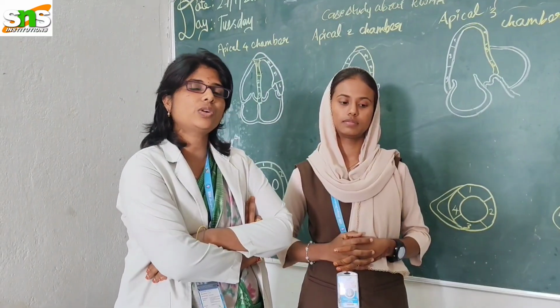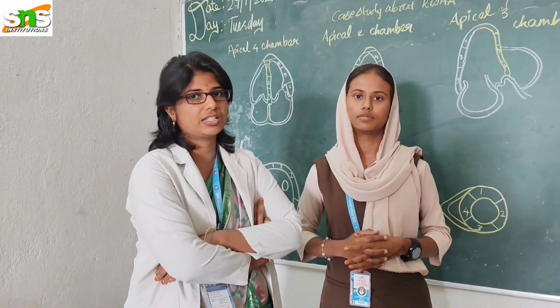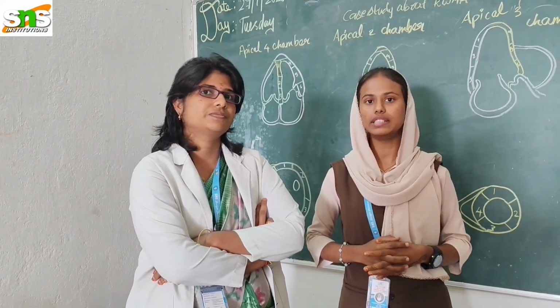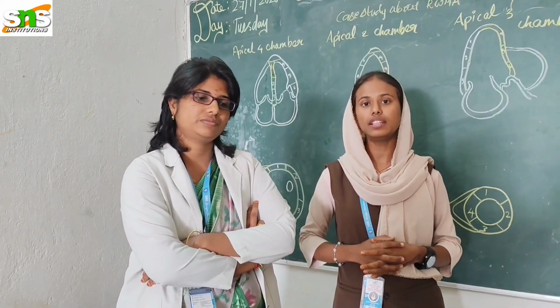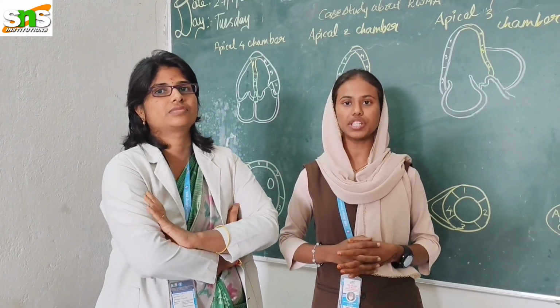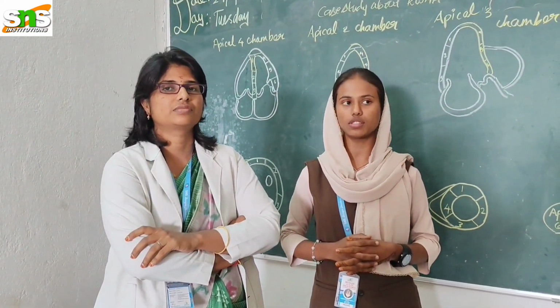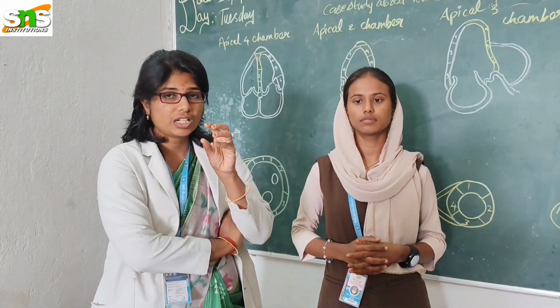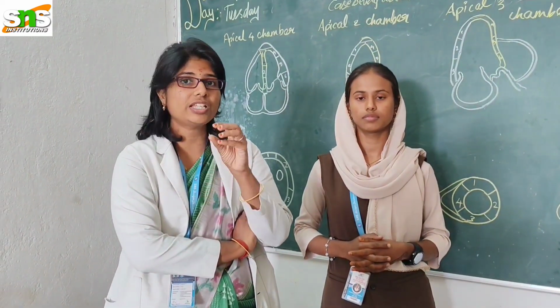Now we'll see the role of echocardiography in ischemic heart disease. Here echocardiography is invaluable in ischemic heart disease because it detects regional and global myocardial dysfunction, which helps to differentiate ischemic from non-ischemic causes of LV dysfunction. So here in this video we are able to differentiate and find out ischemic heart disease.